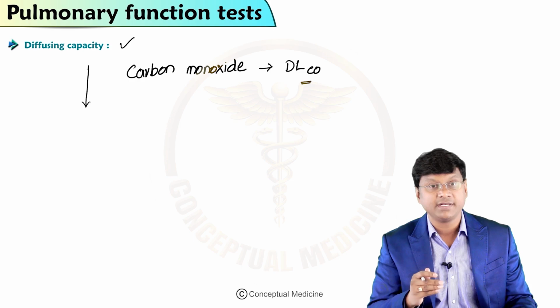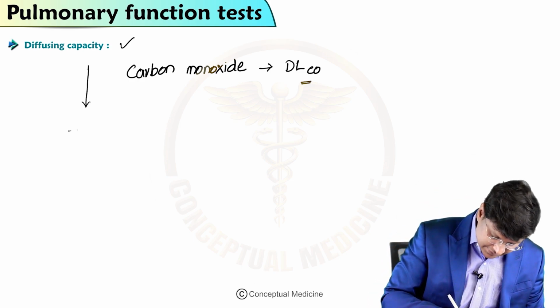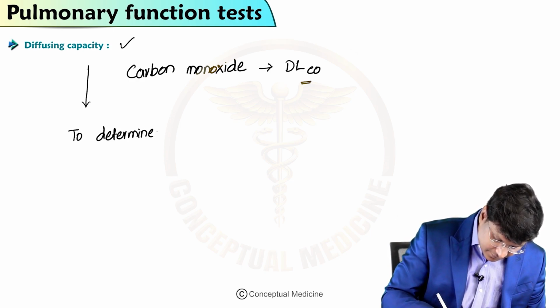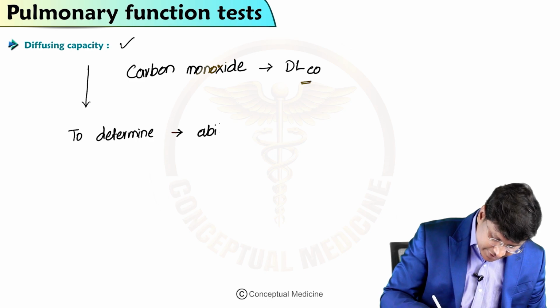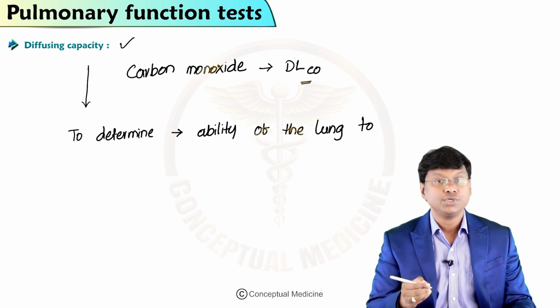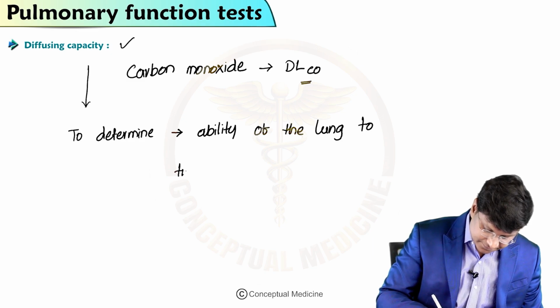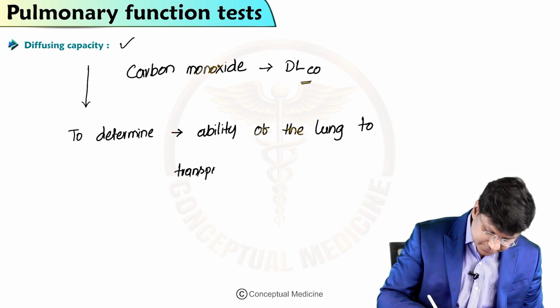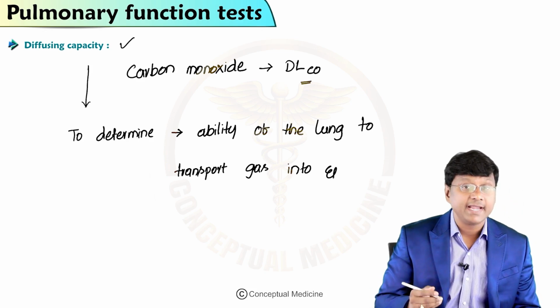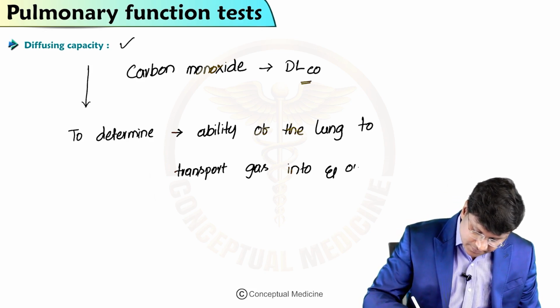It is done to determine the overall ability of the lung to transport gas into the blood and out of the blood.